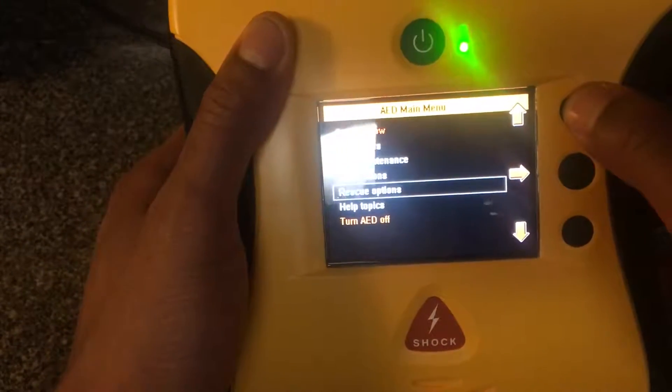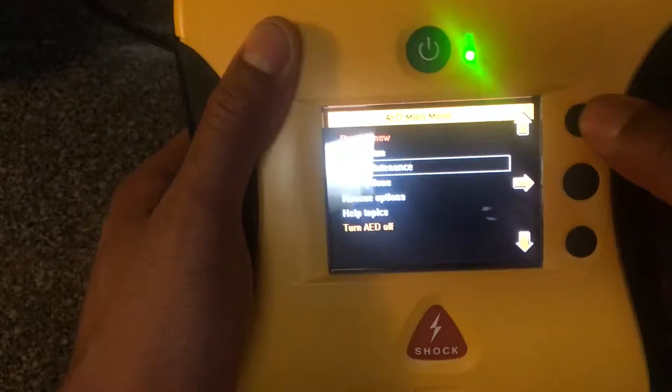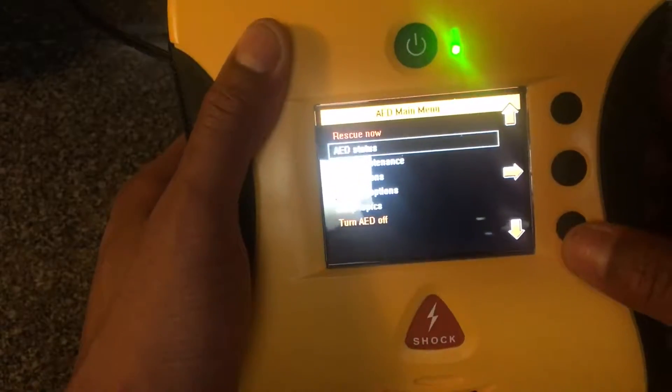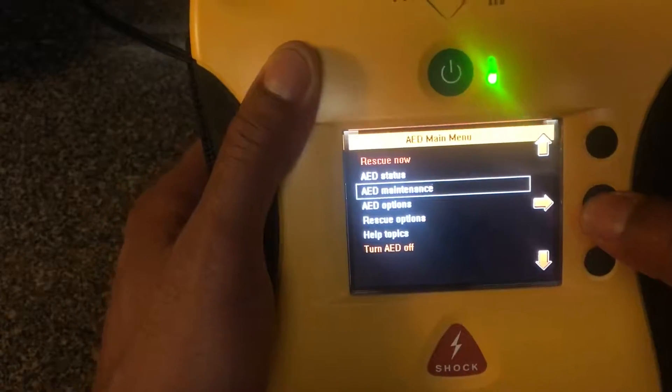It goes through a number of options: AED status, AED maintenance, AED options, rescue options, and help topics. Any of these buttons you can click on. We were just with AED status, so let's go to AED maintenance.